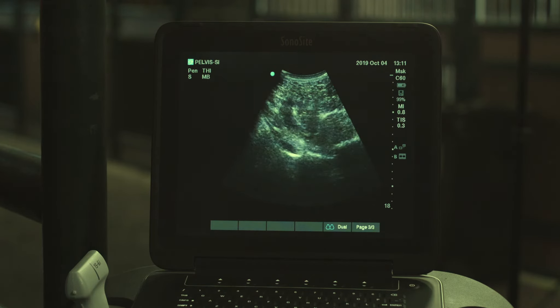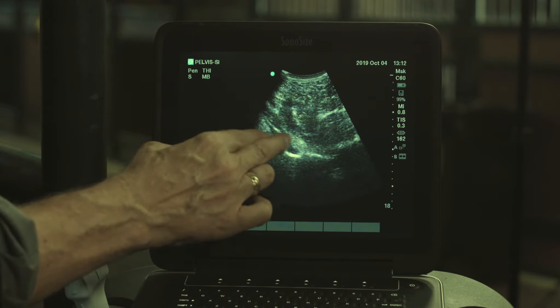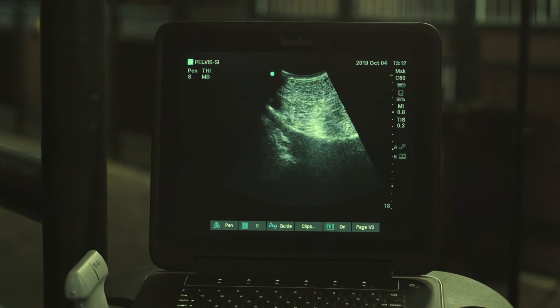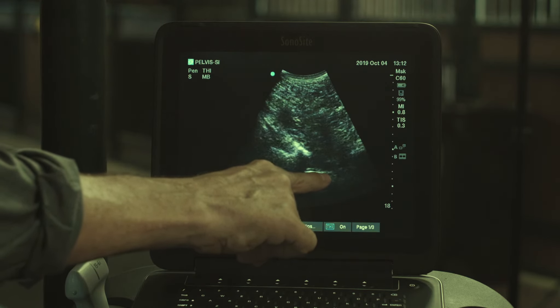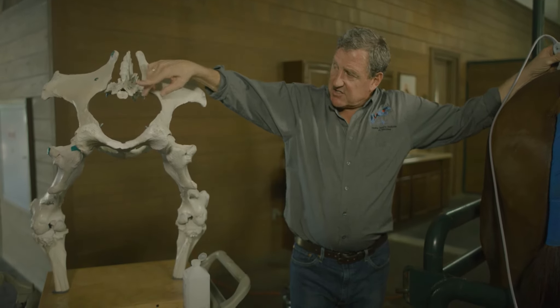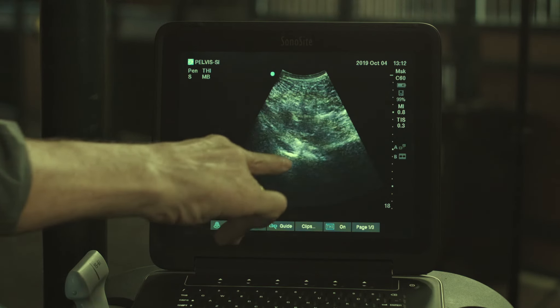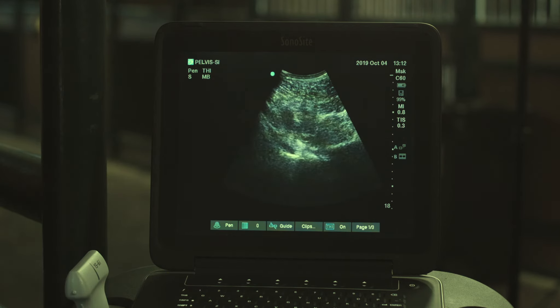As I continue moving the ilium virtually across the screen, we get to where we have the sacroiliac joint — the ilium is here, the sacrum is here — and there's the reverse J with the little membranous portion of the dorsal sacroiliac ligament that you have to get your needle outside of. Your needle will be directed down to this point right here. One thing to note: if you go too far and separate the ilium from the sacrum, the rectum shows up — these moving reflections down in here — which corresponds to moving your transducer into the greater ischiatic notch. You have to keep the ilium and sacrum parallel for the injection.